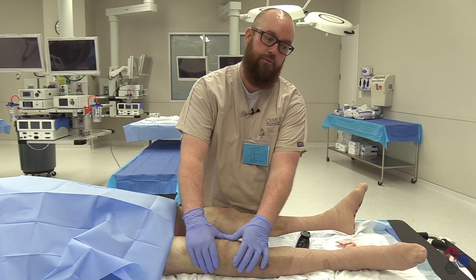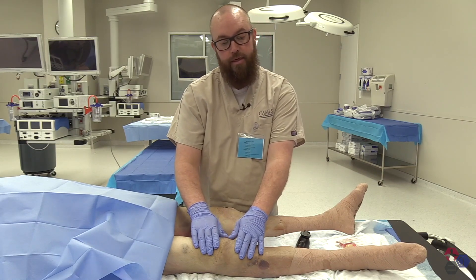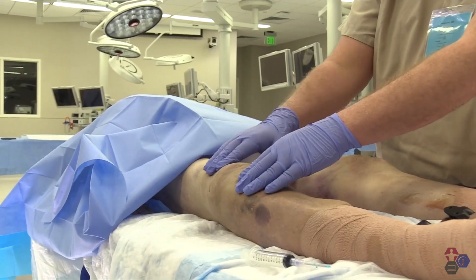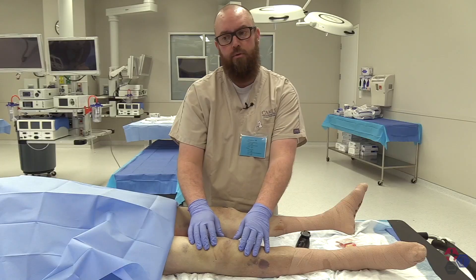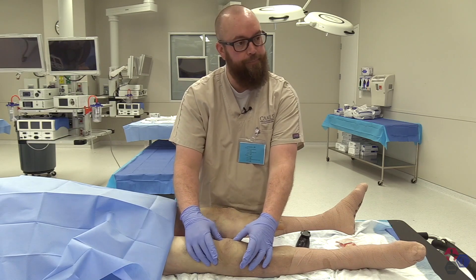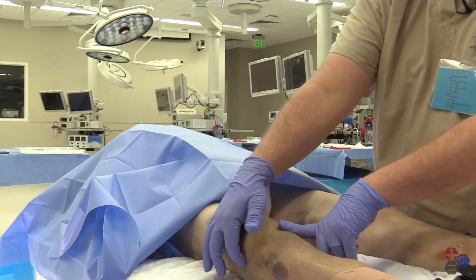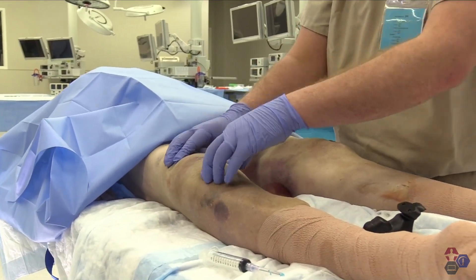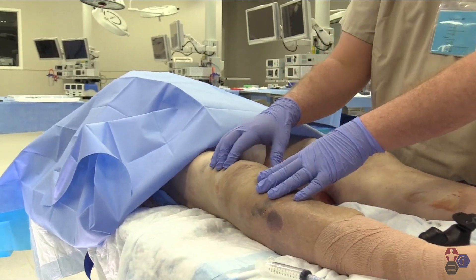The procedure for arthrocentesis is variable. The basics are to avoid the ligaments, tendons, nerves, and veins. The easiest way to do that is by puncturing the skin at one of four corners of the knee: superior lateral, superior medial, inframedial, or infralateral. You want to avoid true superior and true inferior because of the patellar tendon and the quadriceps tendon above.